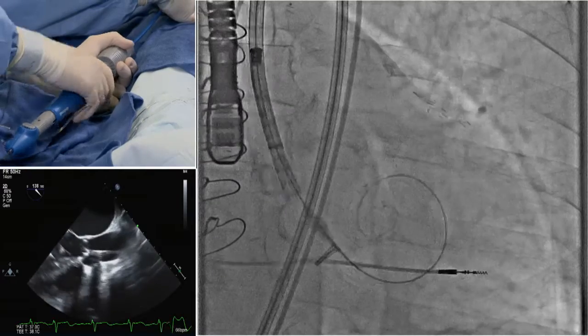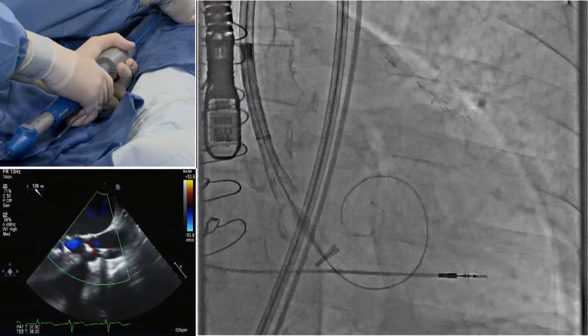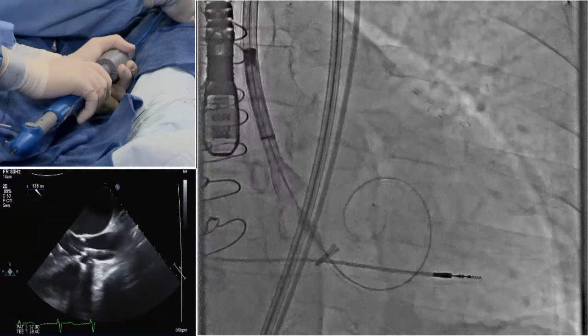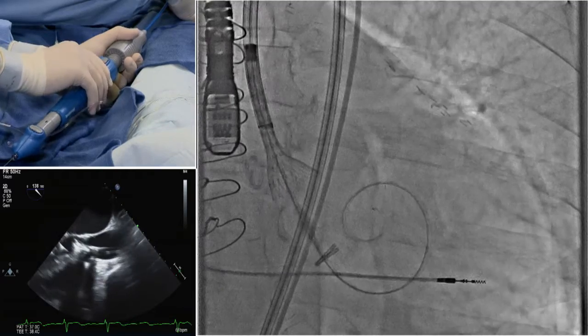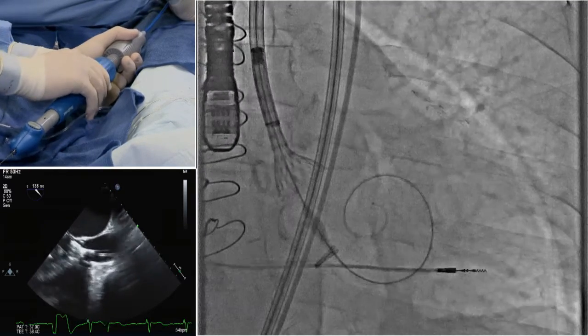While they deploy, a lot of centers with big experience are moving away from general anesthesia. Is that something that you're looking at, or are you still, because I see there's just an anesthesiologist in the room, I assume he's intubated under sedation? Is it something you're planning to do in the coming months?